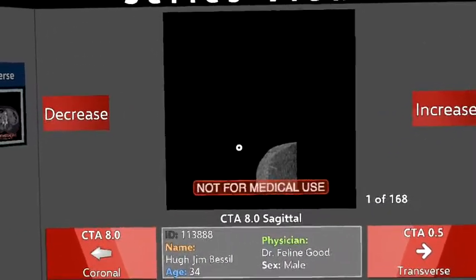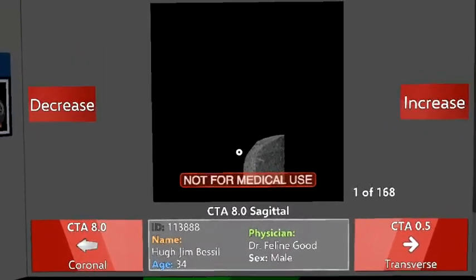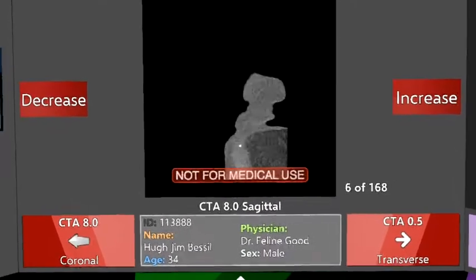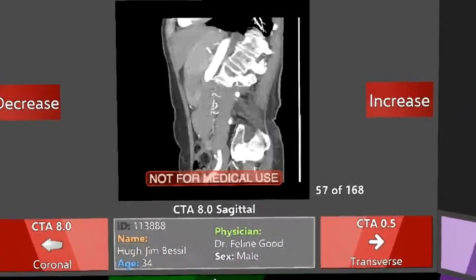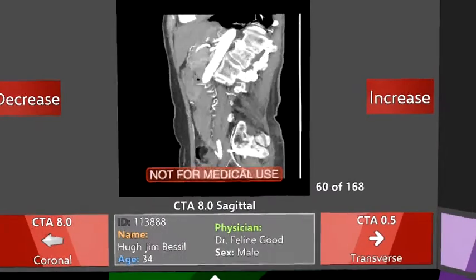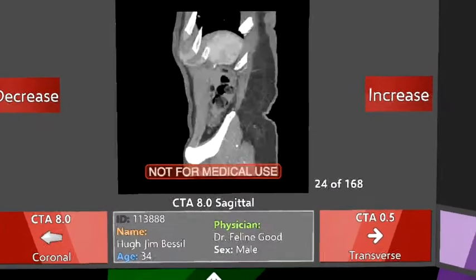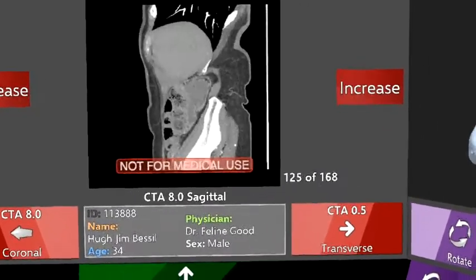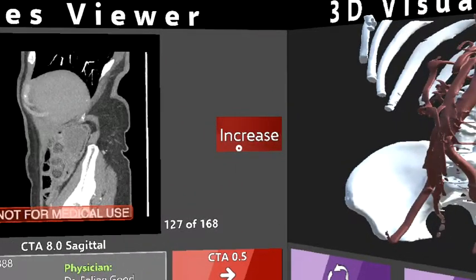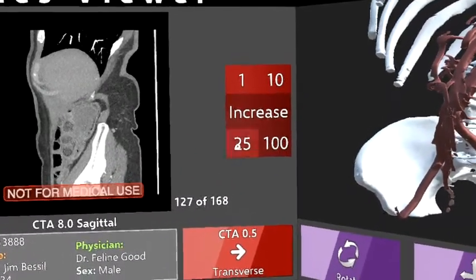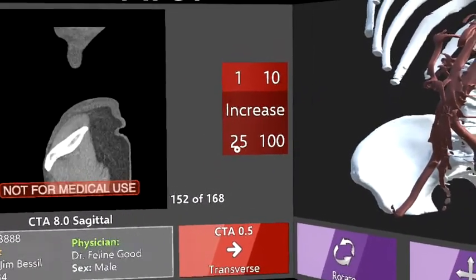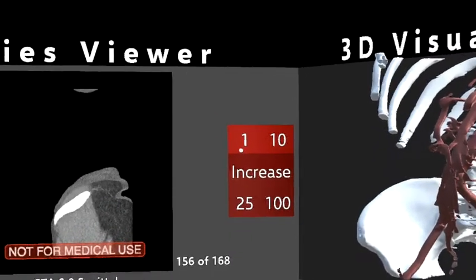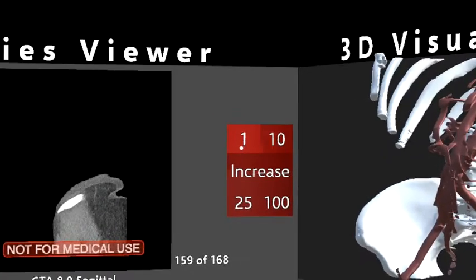Let's take a look at the series viewer. We have the sagittal view and we're going to scroll through it. I have 168 images in this series. I can scroll through it and look through all the different parts, or I can jump to a specific image by number — I can increase or decrease and walk through each image in the series.